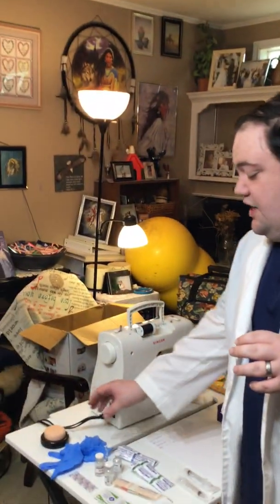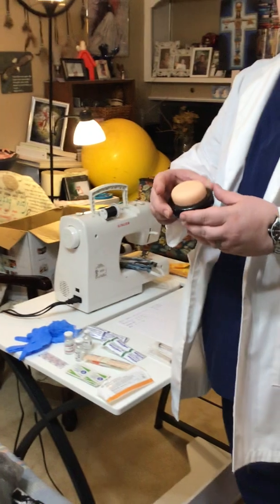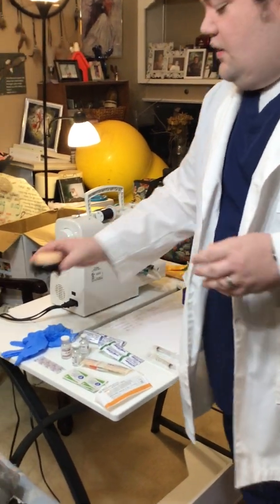Today we're going to demonstrate for you the proper medication administration of parenteral drugs. And to do that, we have a setup here because we're not using a live patient or person. We've simplified the process. So to save some time, I'm just going to walk you through some preliminary steps, and then when it comes to the actual injection, we're going to use this demo dose injector pad learning aid.